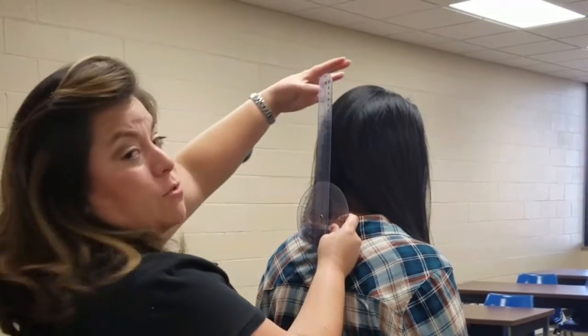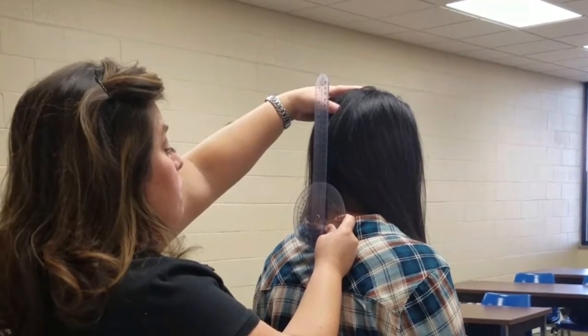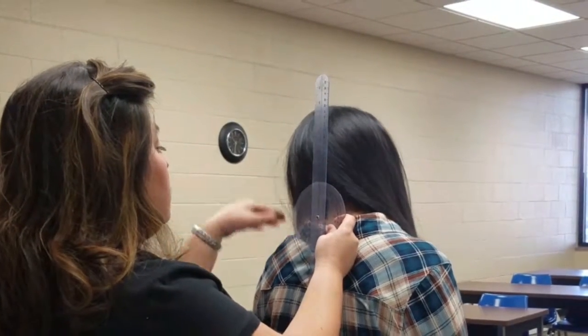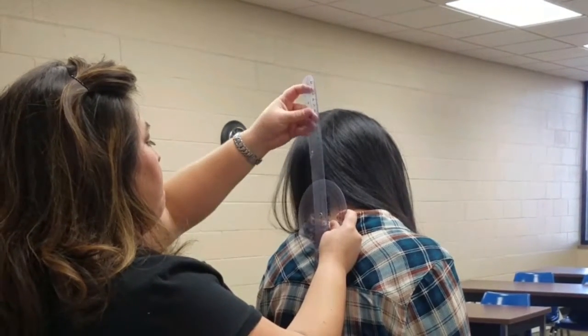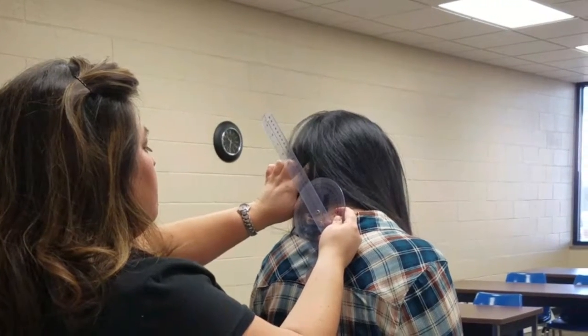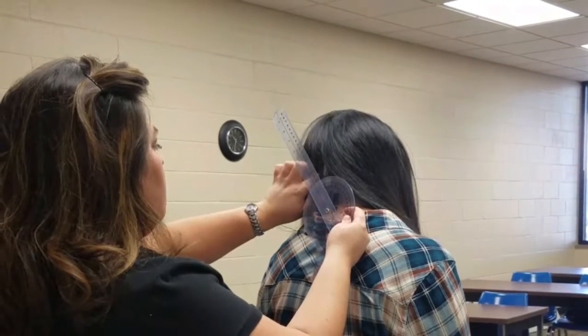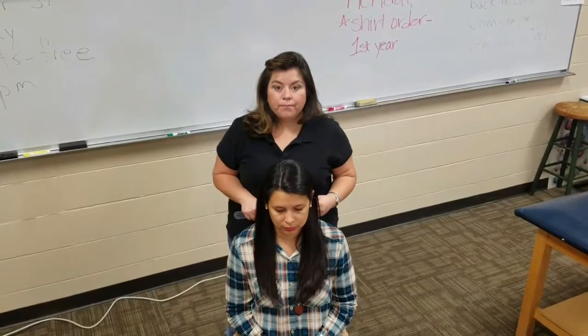All right, and now I'm just going to have her go into left lateral flexion of the cervical spine. So can you put your left ear down to your left shoulder? Feel for that. All right, so I have her at 40 degrees of left lateral flexion of the cervical spine.